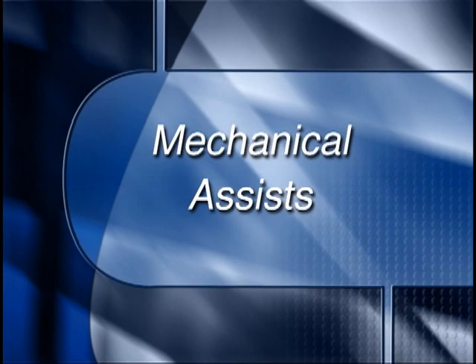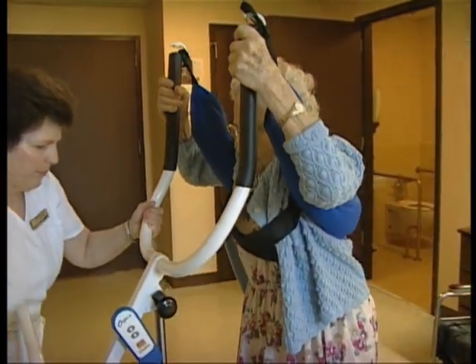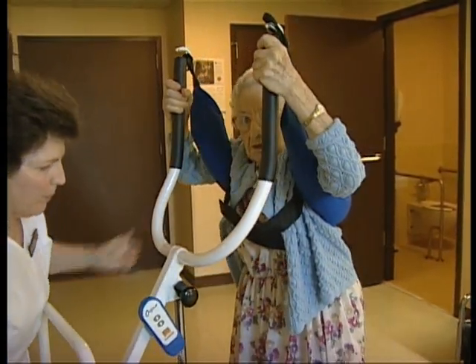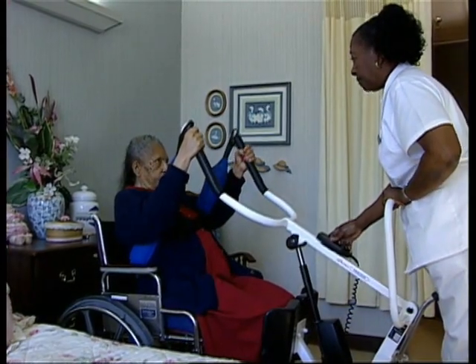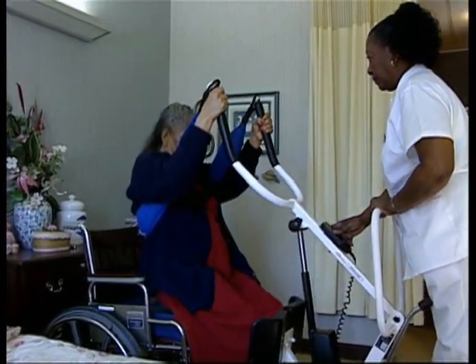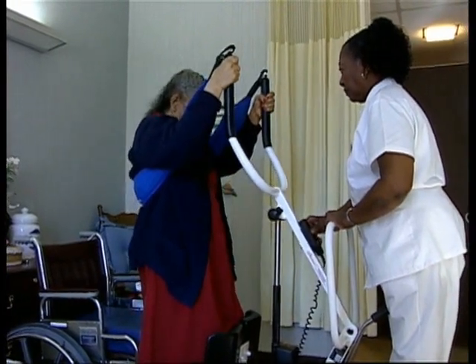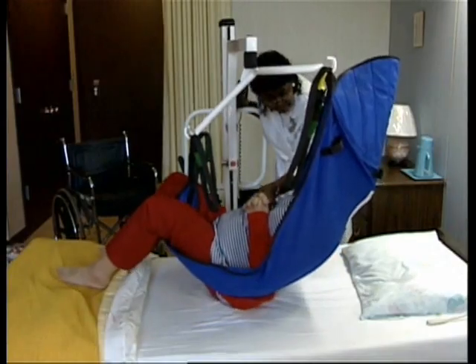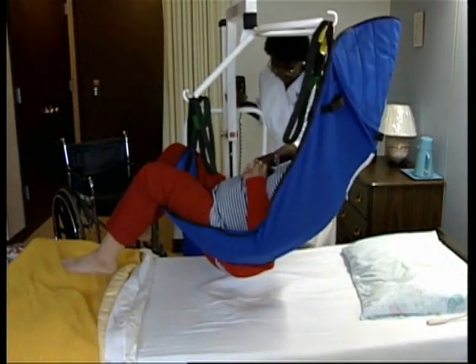Mechanical assists. Mechanical assists are usually appropriate for heavier residents or residents who lack mobility and are in a weakened state. One of the most common types of equipment used is the mechanical lift. Although there is a wide variety of lifts available, most of the mechanical devices operate along the same basic principle, supporting the resident in a seated position on a sling and elevating him or her mechanically.